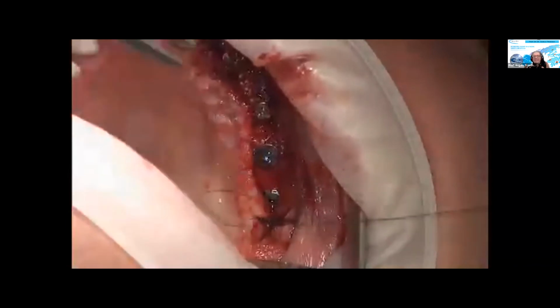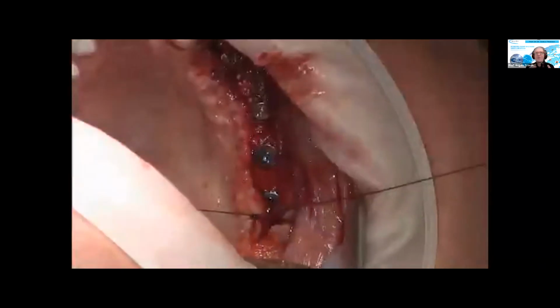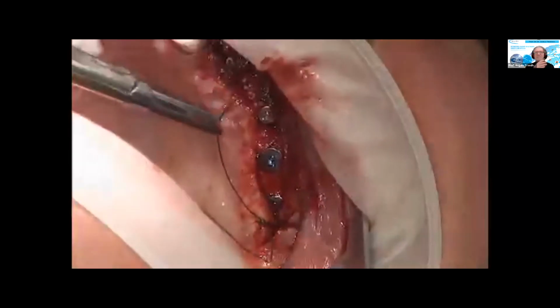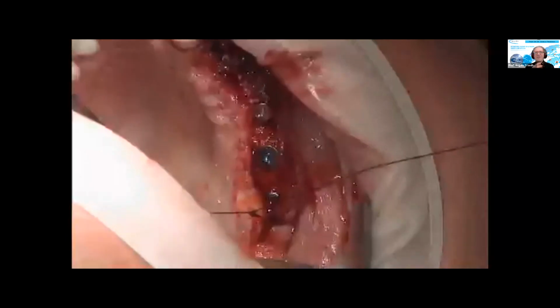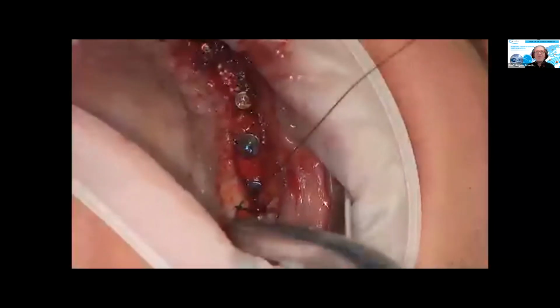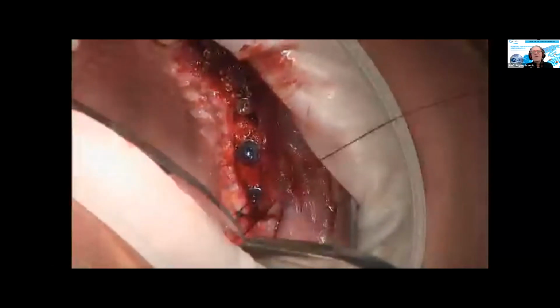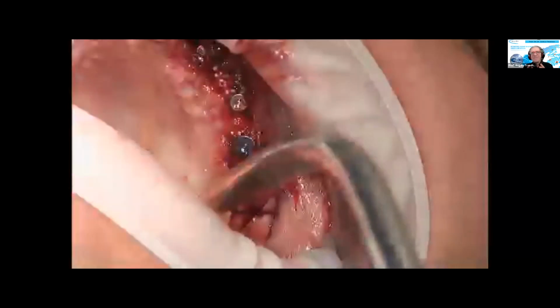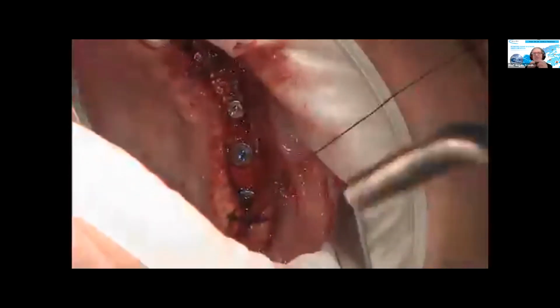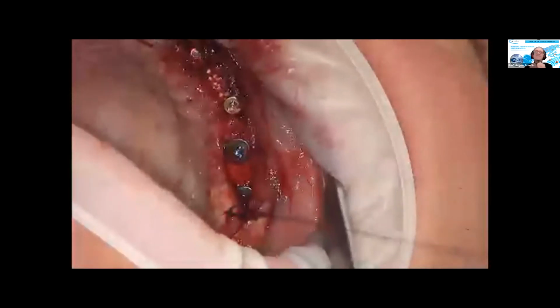And this is a task a general surgeon, abdominal surgeon, orthopedic surgeon, whatever surgeon you might imagine, finds very easy, because if it's orthopedic surgery, a leg, an arm, or if it's abdominal surgery, it's the belly, you can immobilize it quite good. But in the oral cavity, immobilization, which is the very, very basic demand for proper wound healing, is very difficult.